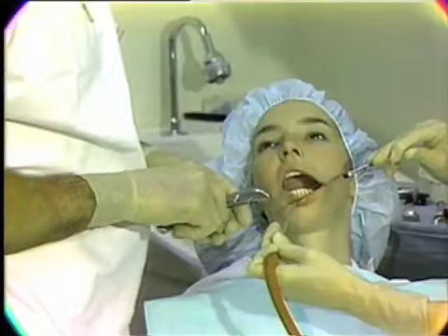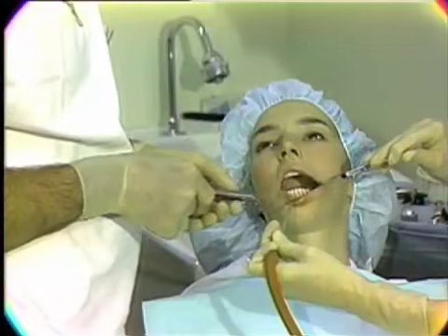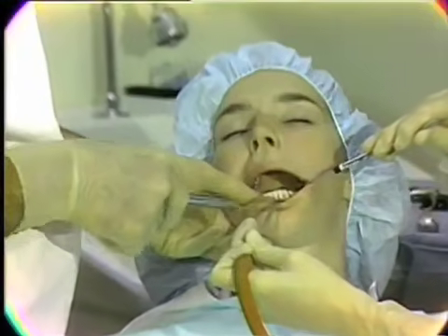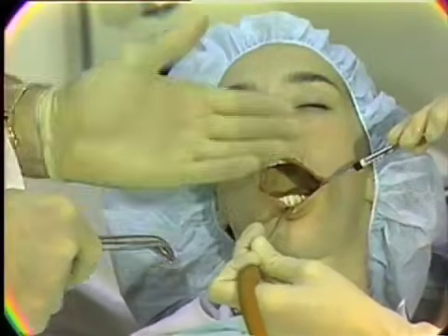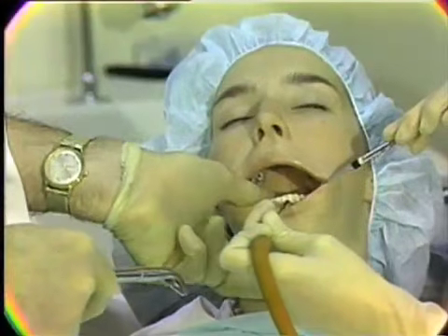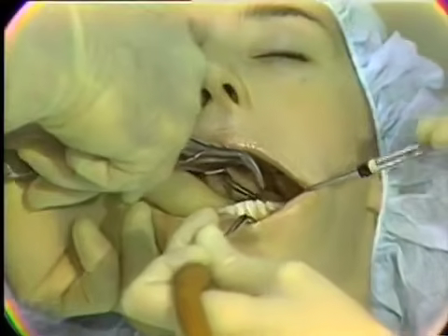In the traction that's required to break down the periodontal membrane and expand the alveolus to lift the tooth from the socket, it's necessary to support the jaw so that the mandible is secure while the tooth is being mobilized from it. In that effort, then, one can use the opposite hand, placing the thumb on the occlusal surfaces of the teeth on the opposite side, a finger at the inferior border of the mandible, and then the beaks can be applied to the tooth in question.